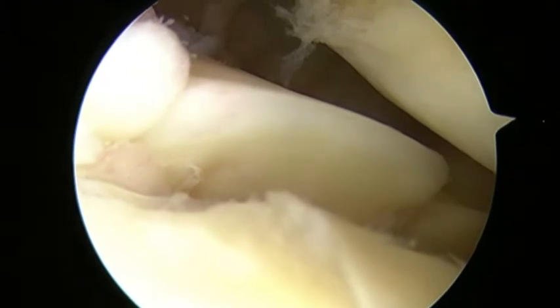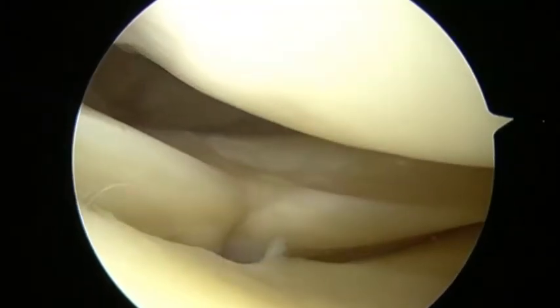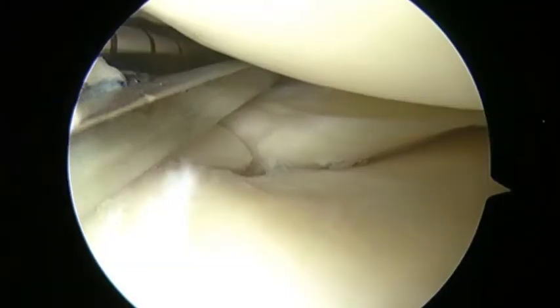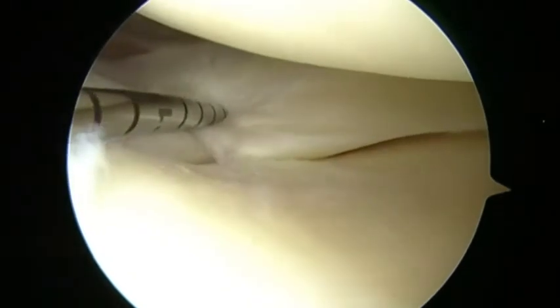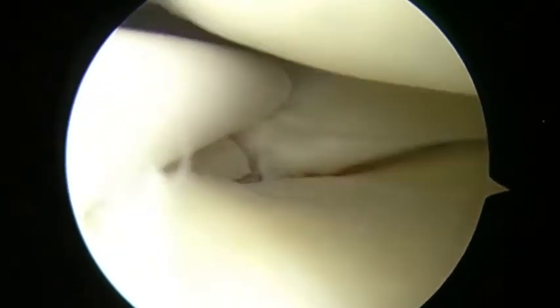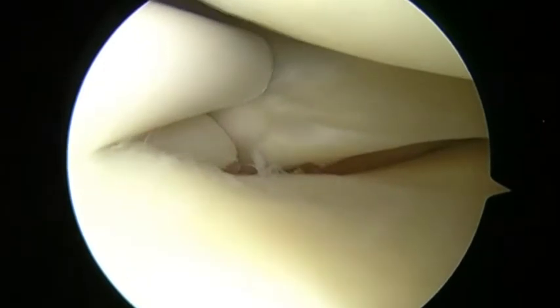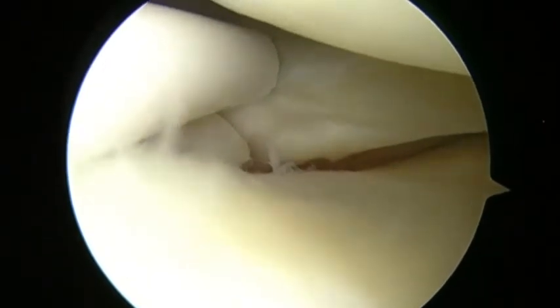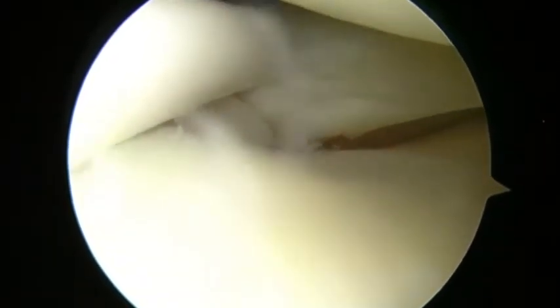This is a left knee in a figure-of-4 position and we are viewing from the anterolateral portal. This is a LaPrade type IIb lateral meniscus root tear with a significant lateral root stump. This type of lateral root tear is not ideally repaired with transtibial pullout sutures.